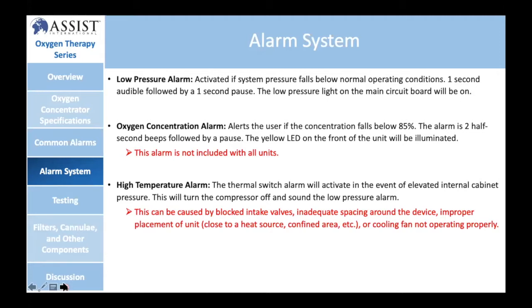With high temperature, if you recall, I had mentioned that you move the device away from the walls, make sure that the cabinet filter is clean. These are some ways that you can make sure that your device does not overheat.